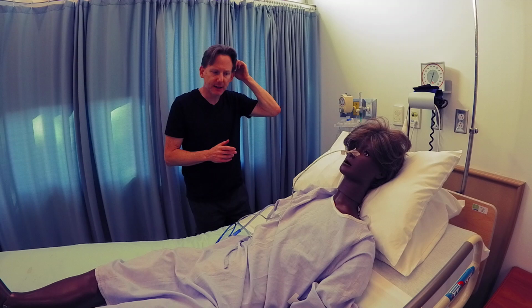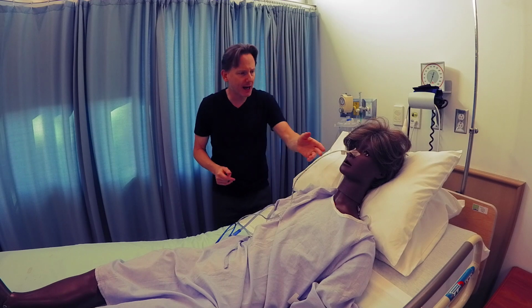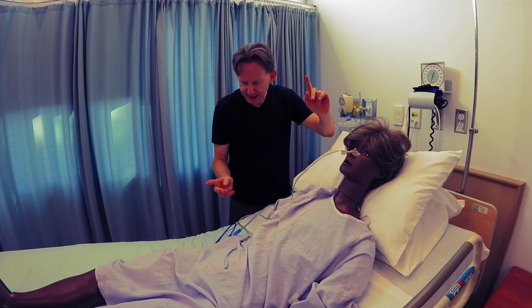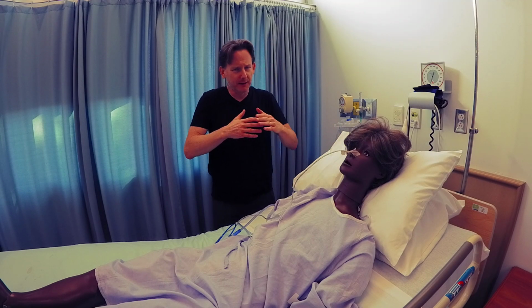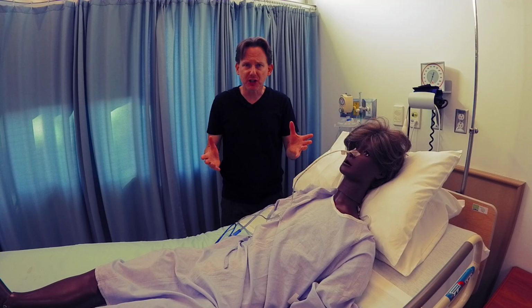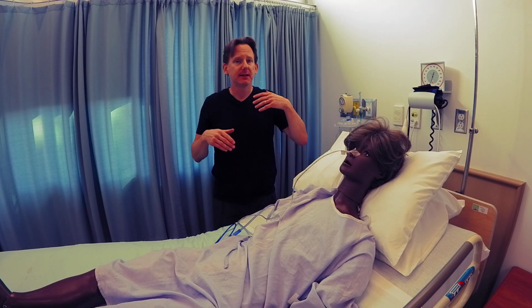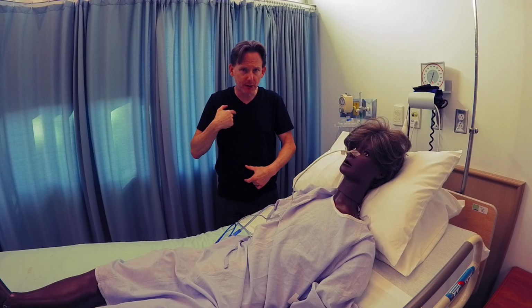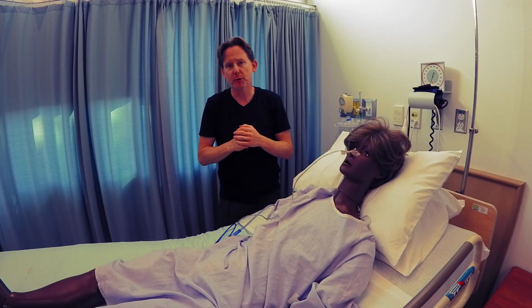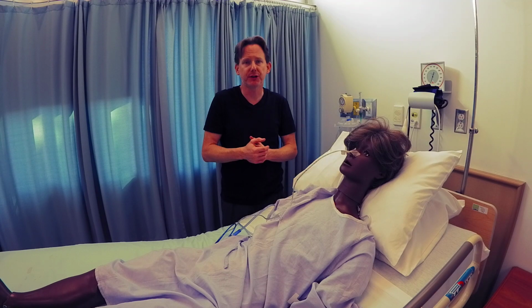First of all, assuming all the suction's working and everything, the tube might be in the wrong place. So the first thing we're going to check is our internal and external measurement, where it should be. If it is, then we know in terms of how it was initially placed, nothing has changed. But maybe what we need now is an x-ray to see if it's actually sitting in the right place in the stomach. It could be that it's in the stomach, but it's still pretty high. Maybe the initial measurements were not taken correctly, and there's still fluid building up below the NG tube, and it needs to be pushed in a little further. So again, one intervention might be to get an x-ray to check placement of the tube.